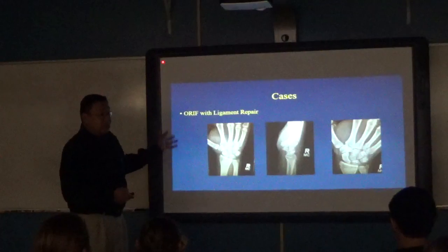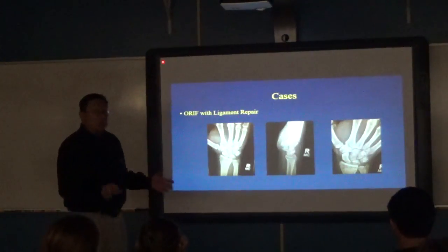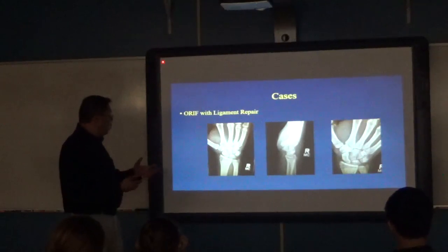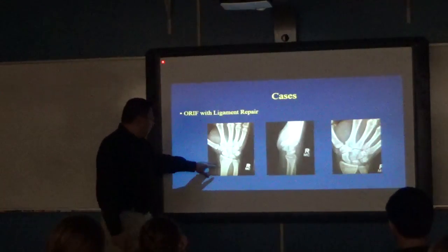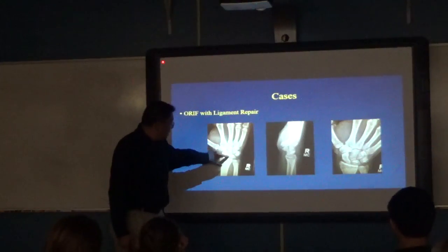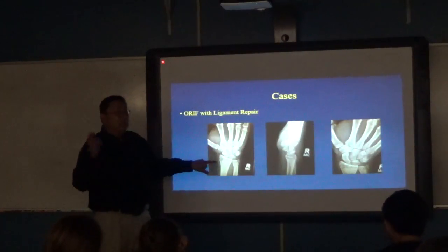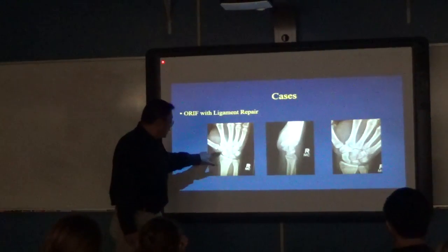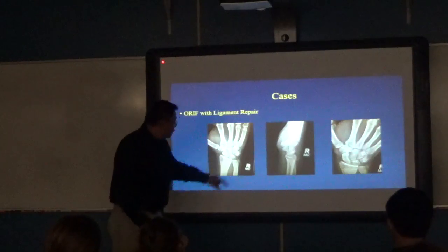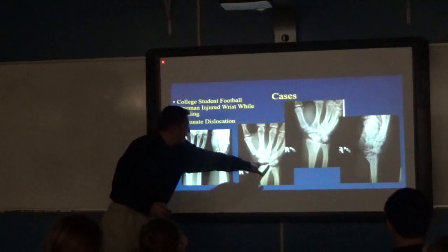Believe it or not, it's been missed by a lot of ER physicians. And that requires open reduction internal fixation, meaning that we open it up, reduce the bone, and I use anchors here to repair the ligaments. And that's what it's supposed to look like. See the spaces? It's what we call Gilula's line, by Dr. Gilula at Washington University, who did research on Gilula's line. You follow those lines, compare to this x-ray here, and see, it overlaps.